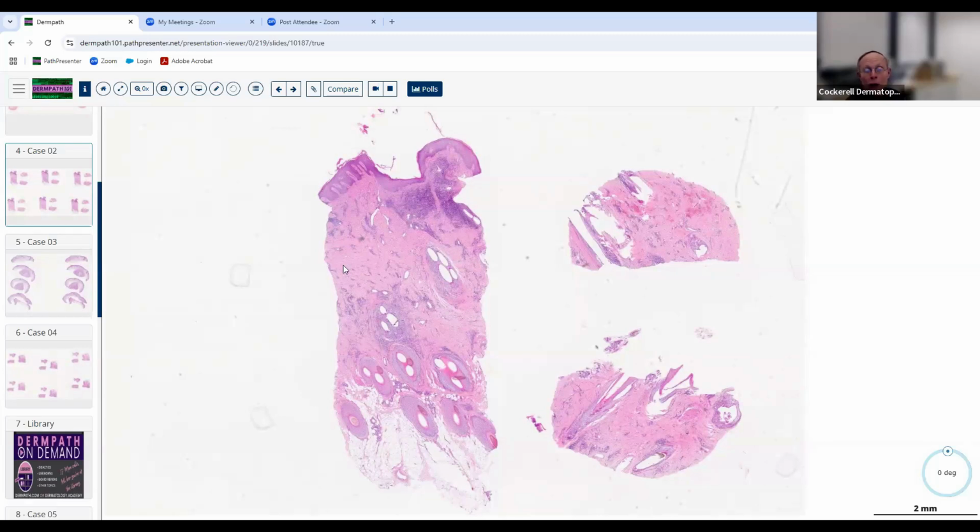Do you recall how to go down that pathway? What's your approach when you're looking at an alopecia? When you're taking the board examination, your heart rate doesn't go up one beat, because you say, I've got an approach here. I'm just going to systematically go through it, make the proper diagnosis, and then move on to the next case.